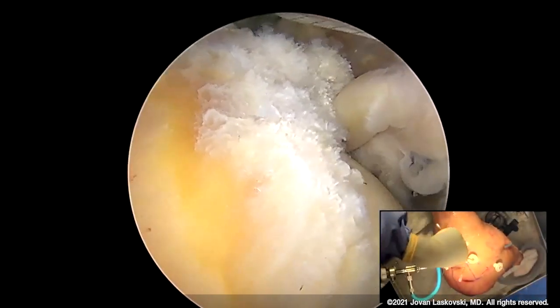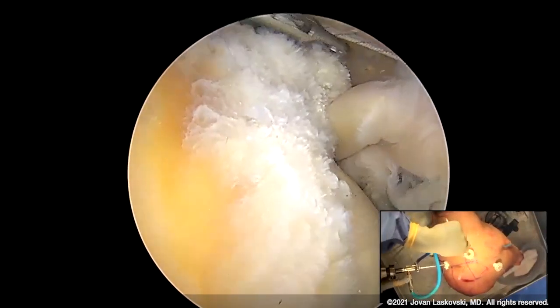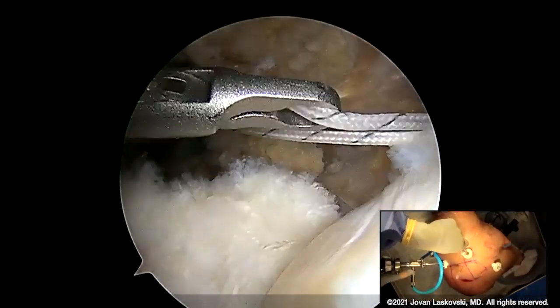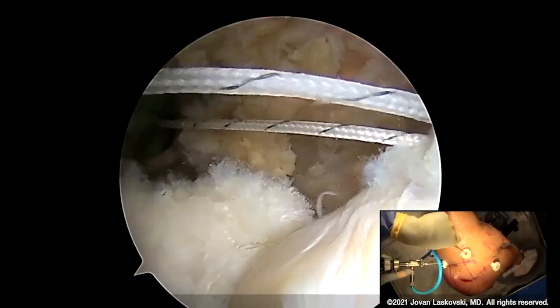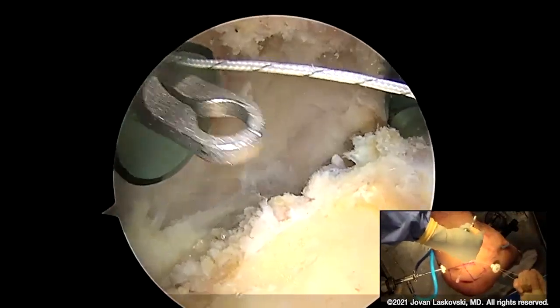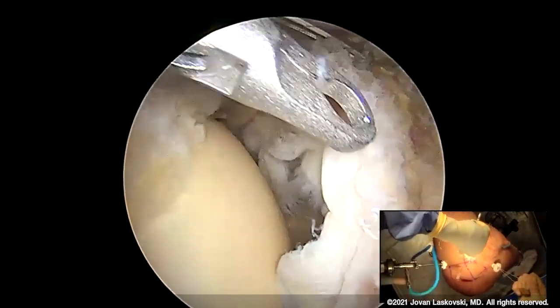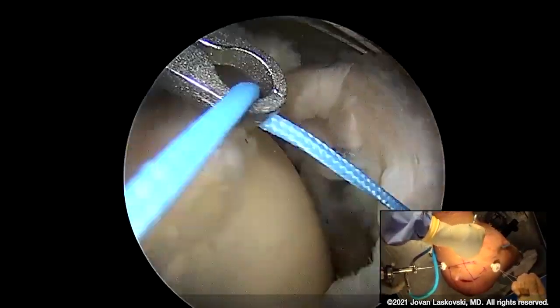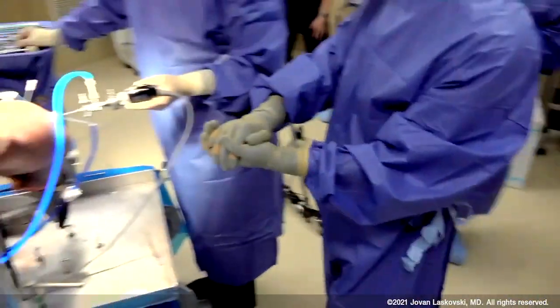We're going to place this through our lateral portal. I'm going to drive up here and grab one and only one suture limb, then bring that through and pull plenty of slack out of it. Then we place our second suture — coming posterior, grabbing one limb only of the blue — and bring that forward. So we're going to walk the graft over.